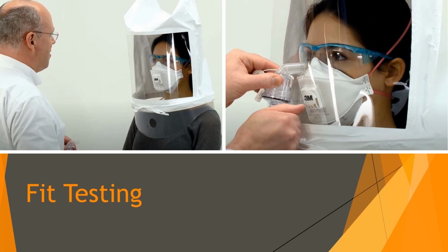You'll be also asked to perform some actions while completing the test, and for this you just need to follow the video. It's just examples of moving how you normally would with a mask on, so moving your head, moving your body a little bit. If you have any questions or any concerns, please ask whoever's testing you on the day, and we'll talk through those with you in person.